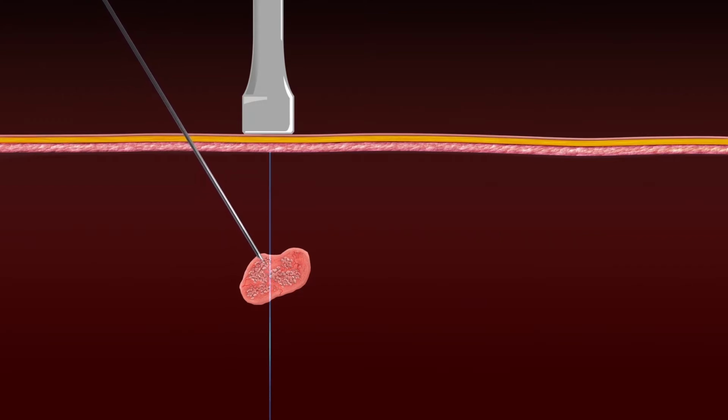At this point, start the sampling with to and fro motions tailored to the size of the target. The needle is only visible as a point on the screen as it travels across the field of vision.